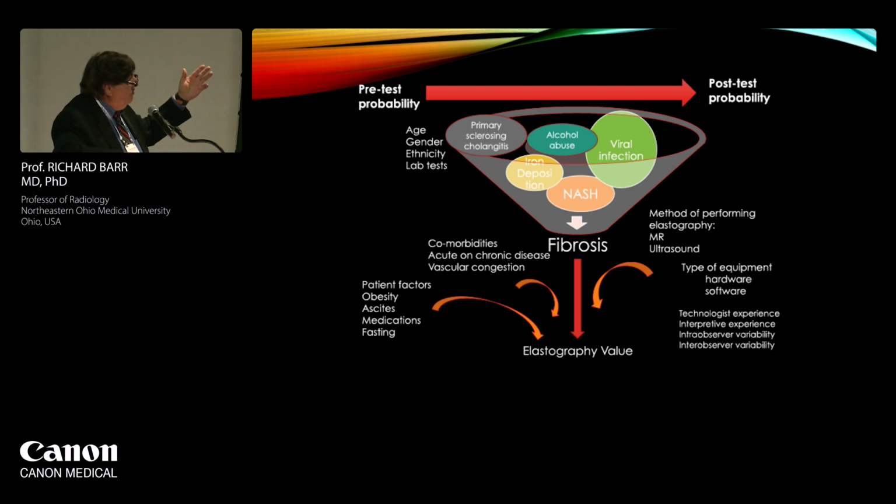We have pre-test probability and post-test probability. We have cutoff values, but they vary on the population. So you have to take in the information. Our values are one of a big piece of information that we have to put together to understand this. So what I like to say is if you have a cirrhosis clinic, you don't want to miss anyone. So you may want to lower the cutoff values we give you so you don't miss anyone. By the same token, if you're doing mass screenings, you don't want to overdiagnose, so you may want to raise the cutoff value. So our cutoff values that we're going to give you are general rules for a general population, but depending on your population, you may want to move it.